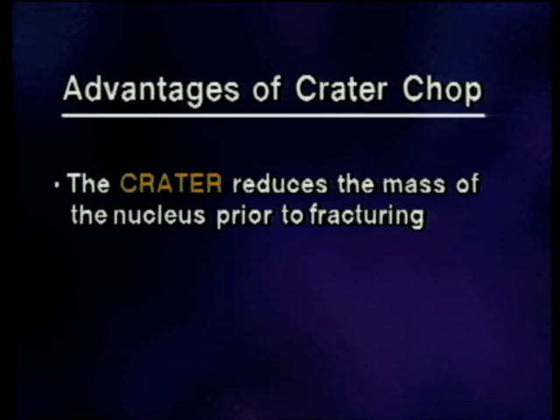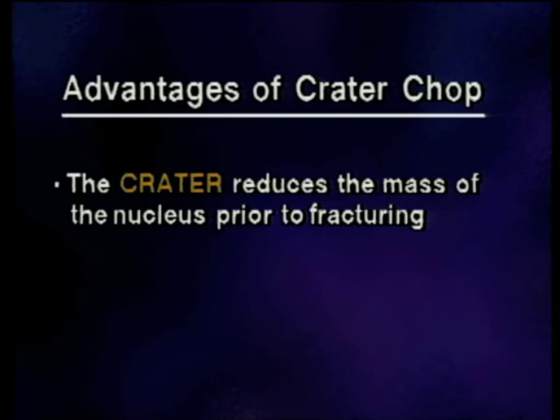For the use of the Series 20,000 Legacy and the 30-degree Kelman tip, I've been able to develop this crater chop technique for the phaco emulsification of very dense, brunescent cataracts. The crater offers the advantage of reducing the mass of the nucleus prior to fracturing, and the chop enables the surgeon to effectively and efficiently fracture the dense nuclear rim. In summary, this crater chop technique extends the safe application of phaco emulsification to even very dense, brunescent cataracts.